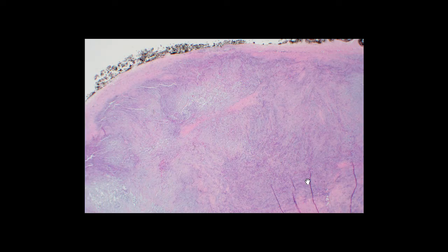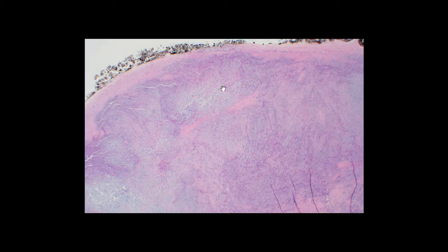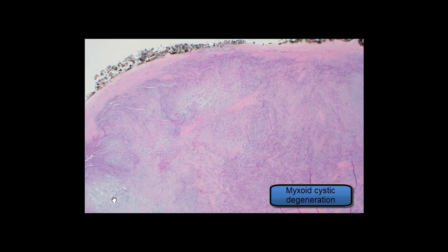From low power, nodular fasciitis usually has a heterogeneous appearance, with some areas being more hypercellular and more fibrous in the background, and other areas being more hypocellular with more of a myxoid background. One of the most useful diagnostic clues, even from 2X magnification, is the presence of these small pockets of myxoid or mucinous cystic degeneration that you can see.